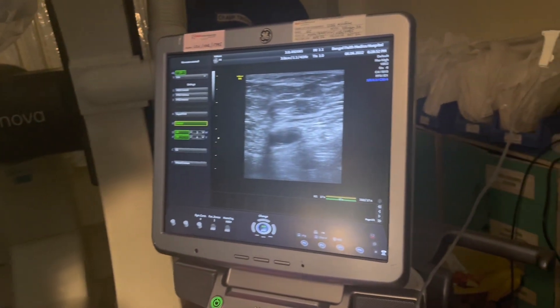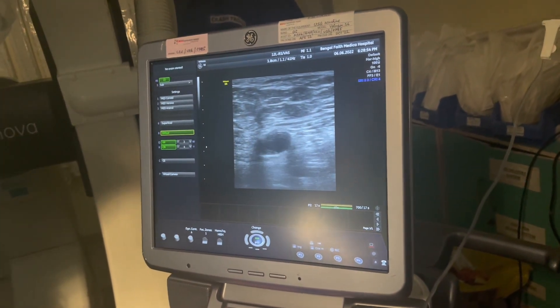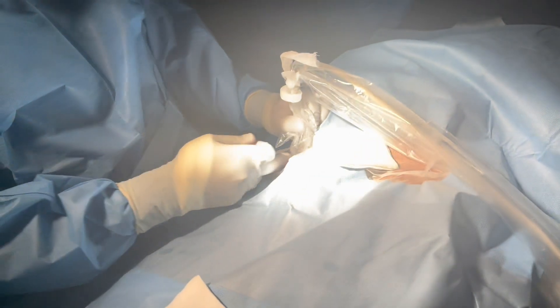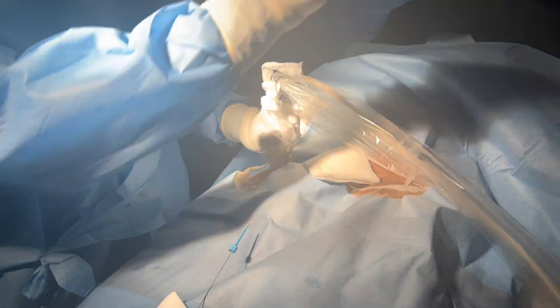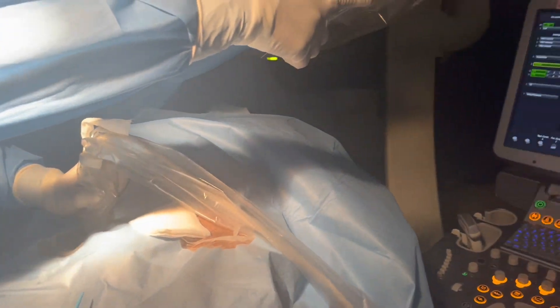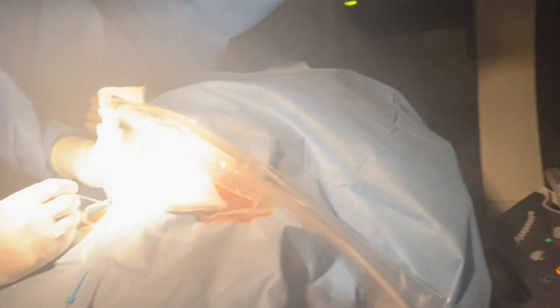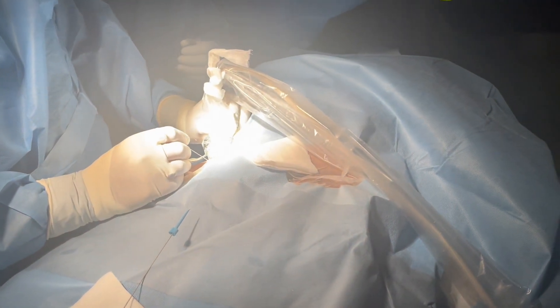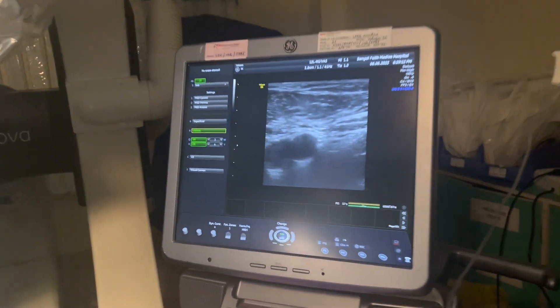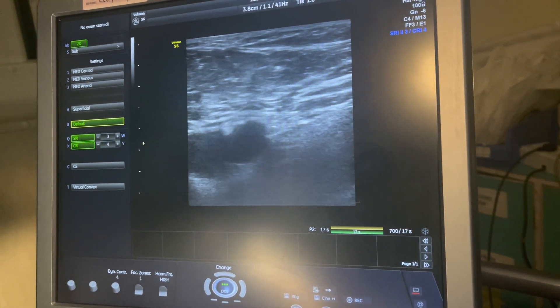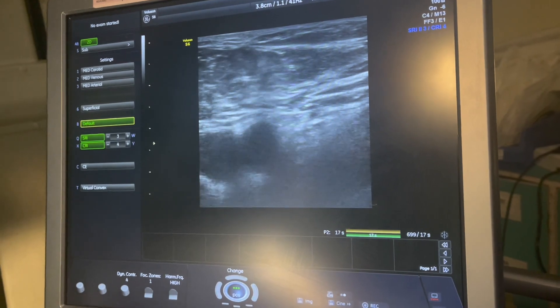Now you see the artery is pulsating. It has to be in the middle of the view — it has to be in the middle. Now you see it is coming. You can appreciate it well. It is going in the entire segment. Now it will puncture it. See here — see how the blood is coming.